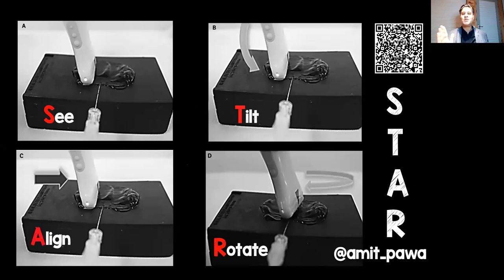Then the next thing you're going to do is you're going to tilt the probe. Forgetting about the needle for now, you're going to tilt the probe so that you get the best view of the target structure, not the needle, the best view of the target structure. So see where the needle's gone through the skin, tilt the probe to get the best view of the target structure, and then use alignment to come now and find your needle. And once you've found the needle, if you are not looking along the whole shaft and the tip, use rotation at the end to see if you can isolate the tip and the shaft.